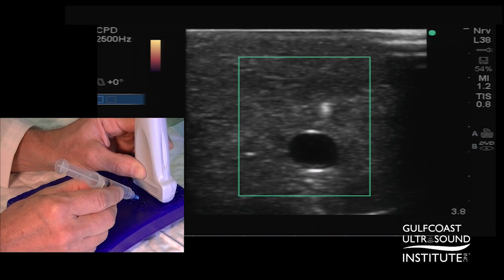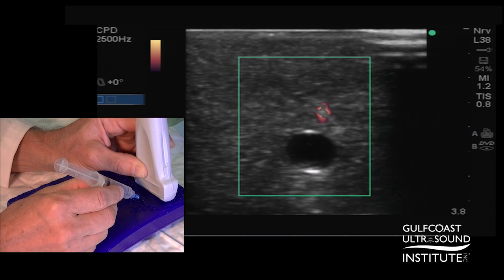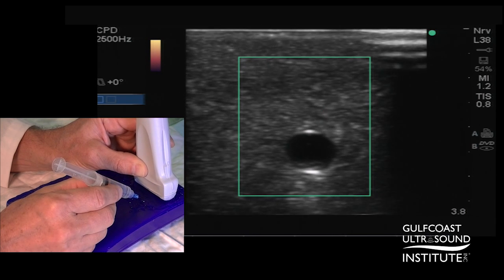Again, advance, slide away, agitate the needle until the power signal disappears. That's the tip of my needle.